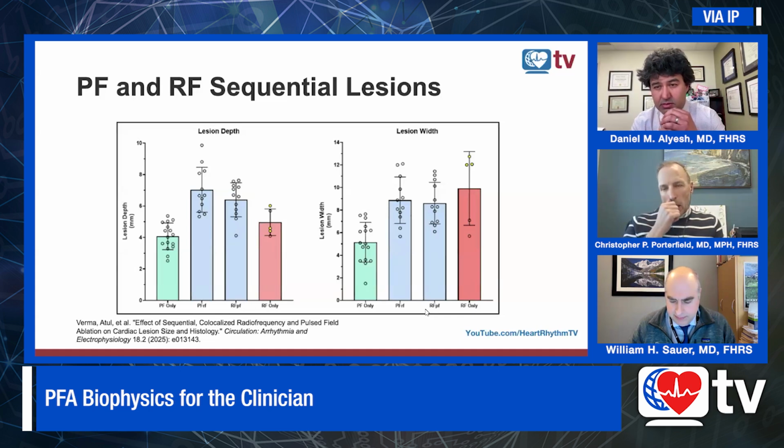Sure. There's a lot to this, and a lot that we're learning on the fly with these. When the waveforms are established, we discussed already this biphasic or multiphasic approach with the short square versus sinusoidal delivery of these packets. With current, you get heat, and there is heat with this energy. The way we get around it is by having delay.